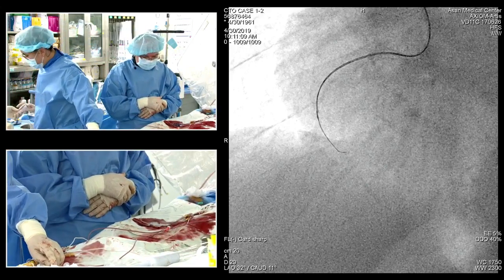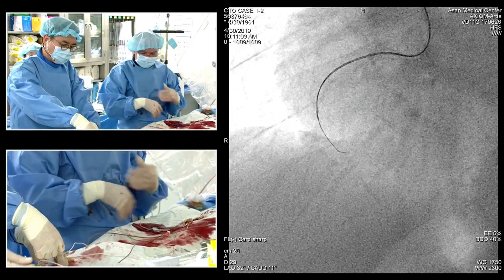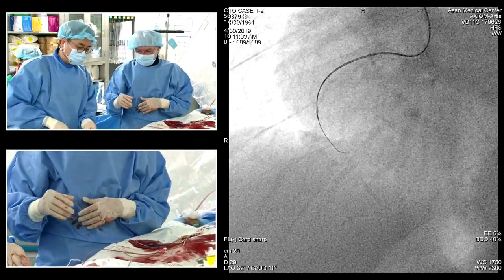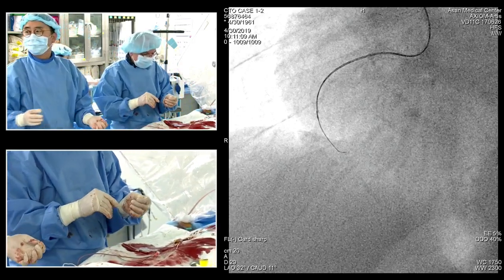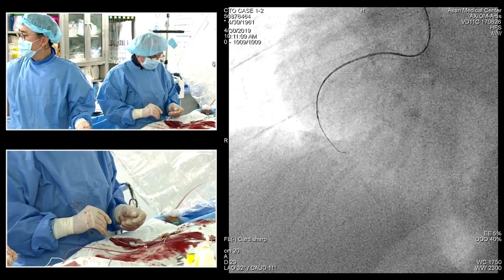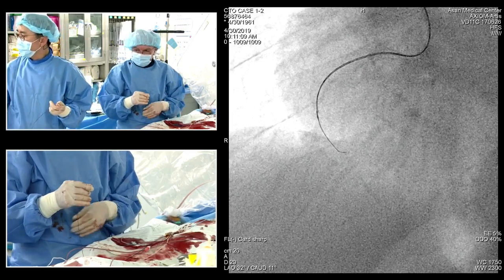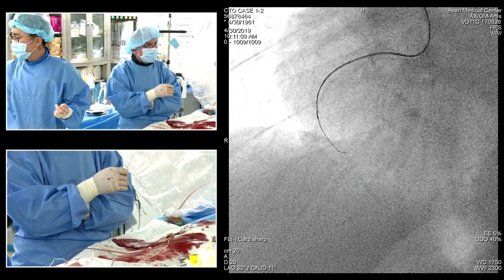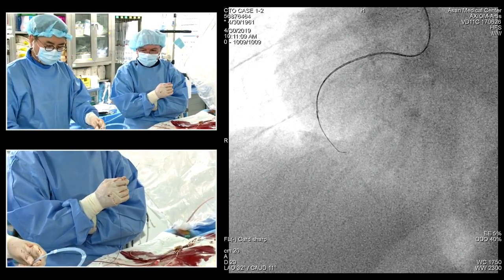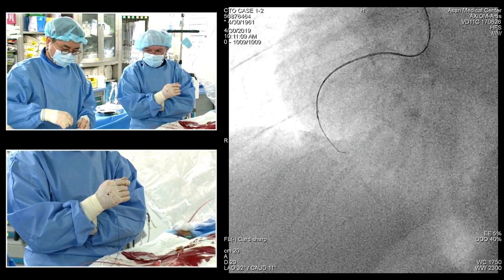Yeah, that's the risk of getting very close with the parallel wiring. Then you think it should work, it should work. It doesn't, not always. Okay. But you know, also the ADR, because you asked me, is not a 100% solution. So once you already tried the parallel, and then you go additionally to ADR, the likelihood of making a good re-entry is very low, especially when you create big spaces there.